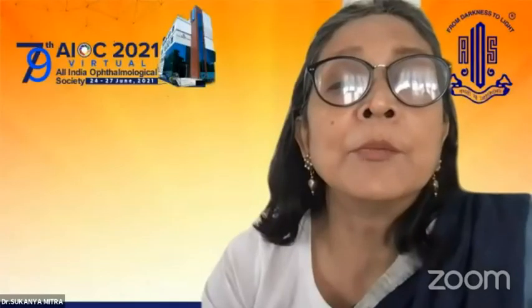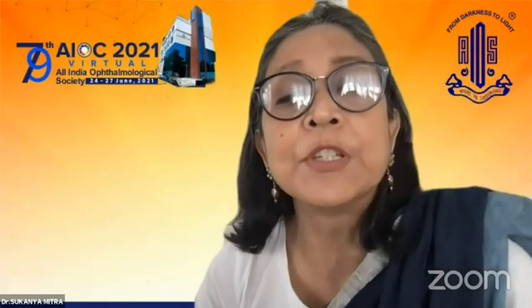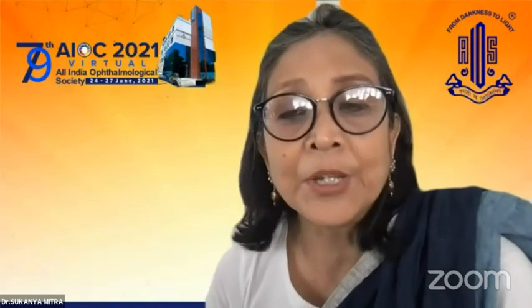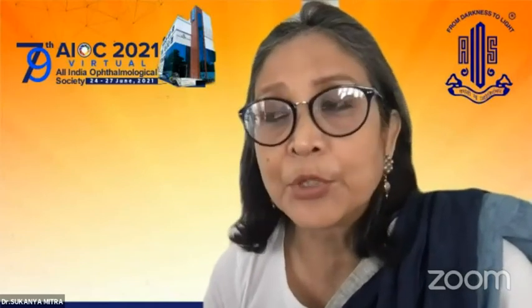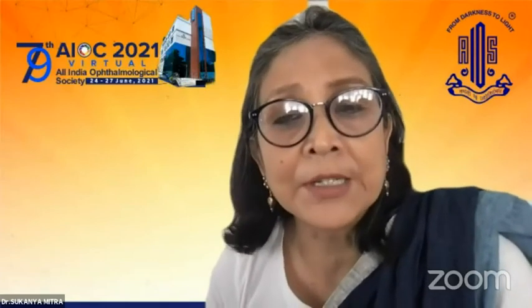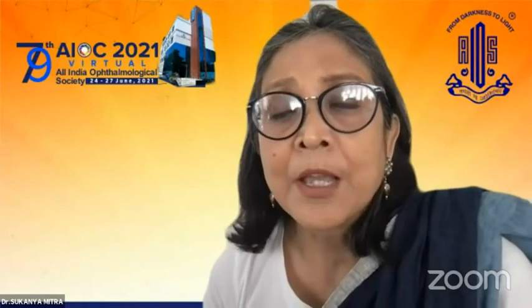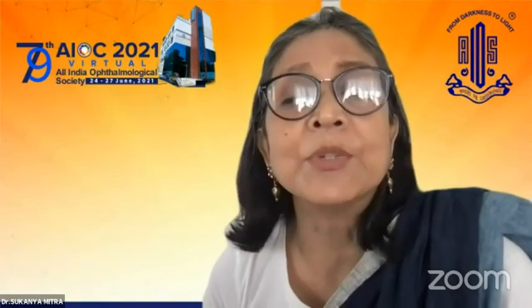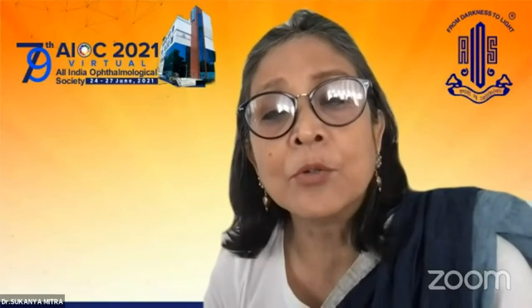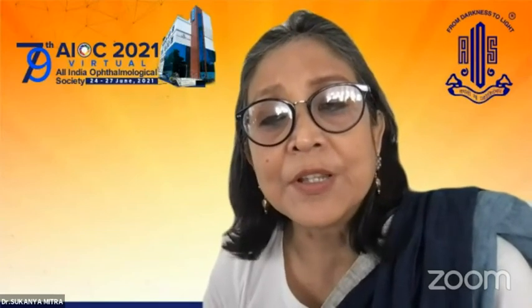Yeah, I'm here. Dr. Chandima, a large number of ophthalmologists still use the direct ophthalmoscope to evaluate. Now, a glaucoma person would obviously be using a lens, a 90 diopter or a 78 diopter lens. But what do you feel about a direct ophthalmoscope? How accurate is it to assess the disc?